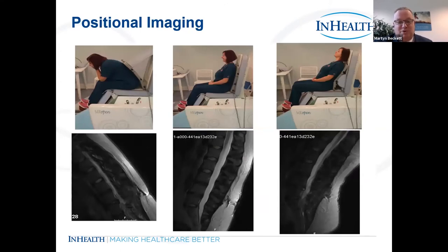One of our centre managers in Birmingham, bless her, with her own spine, really following on from the images that Penny had earlier, just in the different positions we can have them and how that can help our medical colleagues come out with a diagnosis for these patients.